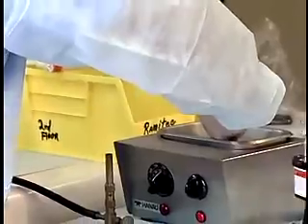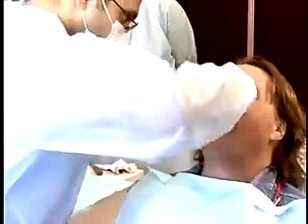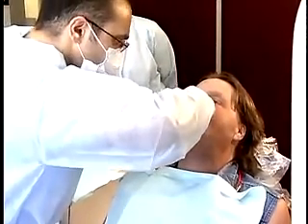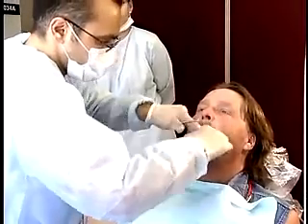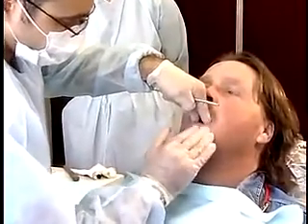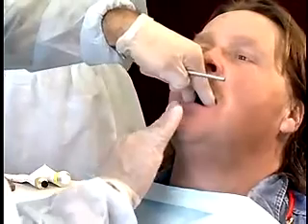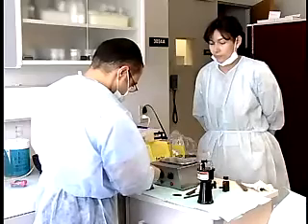Temper the compound by placing it briefly in a 140-degree Fahrenheit water bath. Reflect the cheek while stabilizing the tray with your fingers and seat it in the patient's mouth. Ask the patient to lick the upper lip. Protrude the tongue, draw the lower lip outward, then ask the patient to lick the back. When set, remove the tray and chill it in ice water. Remove the tray, place green stick compound, and chill it in ice water.